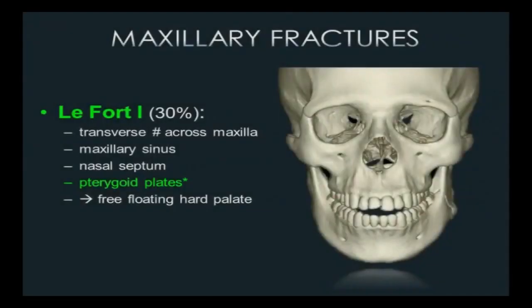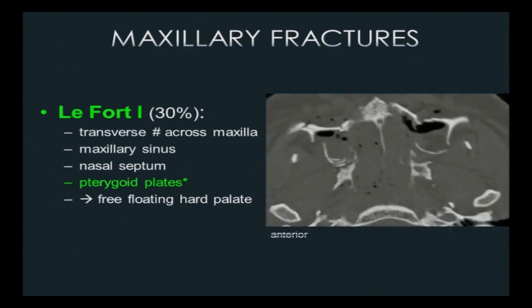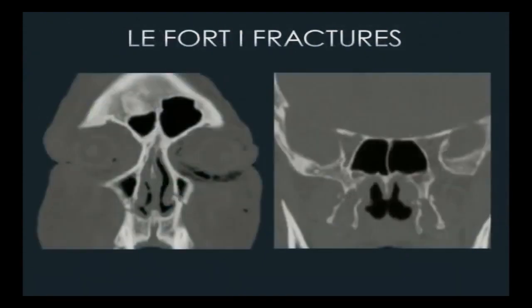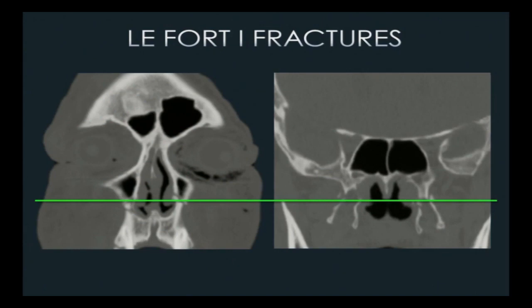The LeFort I transverse fracture goes through all walls of the maxillary sinus, the nasal septum, and the pterygoid plates posteriorly. On axial images at one level you'll see fractures through the anterior, medial, and posterolateral maxillary sinus walls and the pterygoid plates — the hallmark of a LeFort fracture. This results clinically in a free-floating hard palate. On coronal images, you can follow the fracture plane from anterior to posterior, through the nasal region and back through the pterygoid plates — very easy to identify.